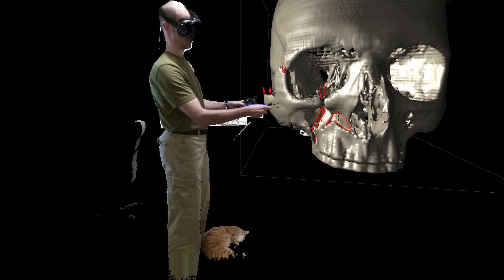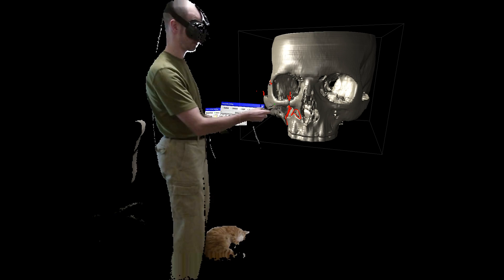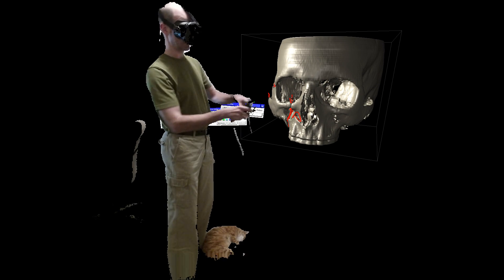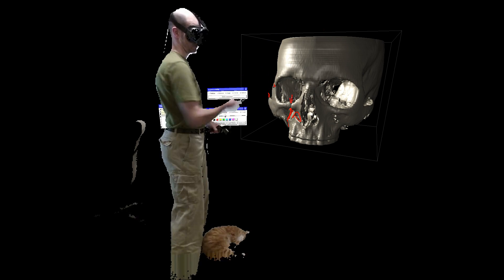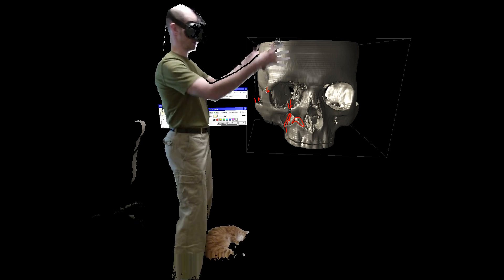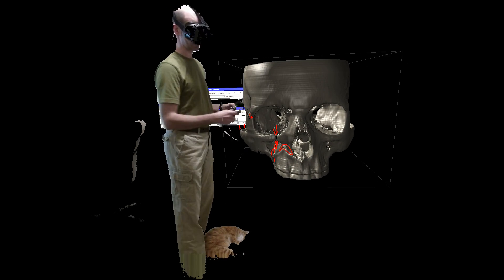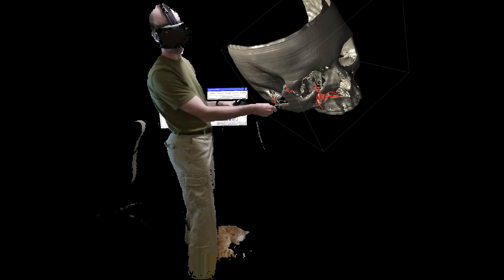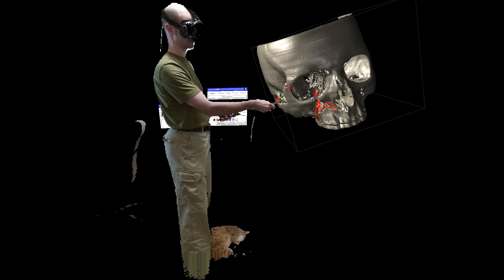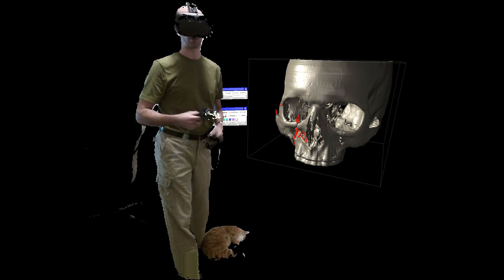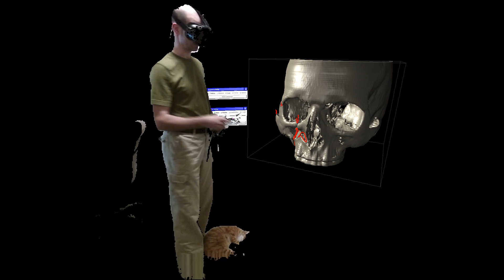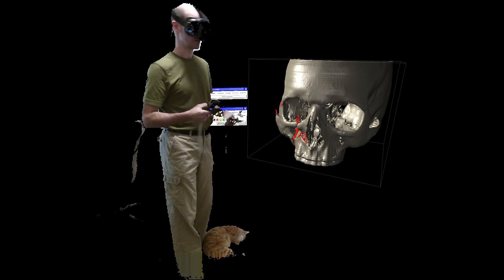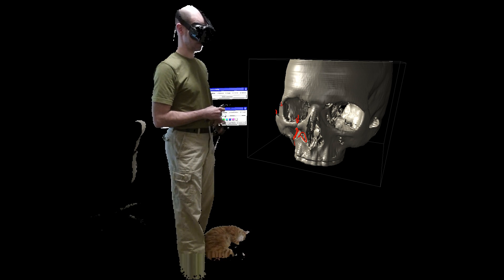And so at least for me, it's much easier to look at this as a surface where you can clearly see what's going on. And the useful thing about 3D Visualizer or generally about looking at 3D volumetric data in a VR system is that we can look at it in this three-dimensional sense. Because we are not projecting the 3D data onto a screen, we're looking at it in physical space. We don't have any distortion. There are no angles that are distorted. Everything is correct. This angle that I measured to be 107 degrees looks to be 107 degrees. Distances appear correct. So it's a very useful way to get a lot of information and knowledge and quantifiable data like these positions, distances, angles about 3D volumetric data sets like this particular medical scan.